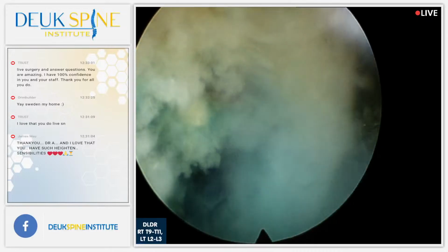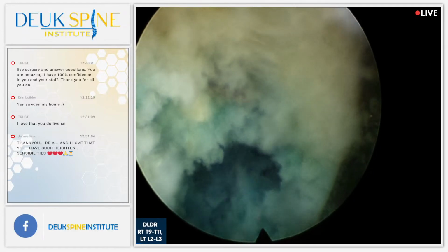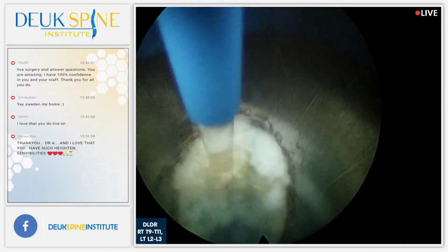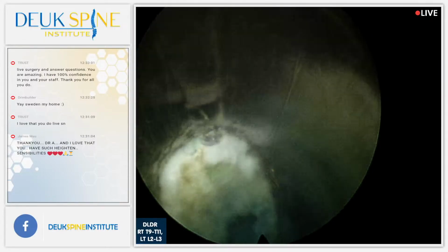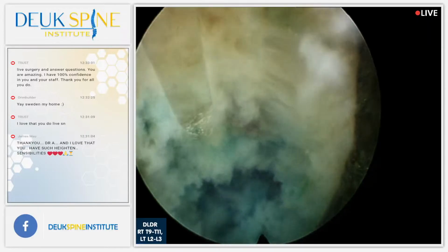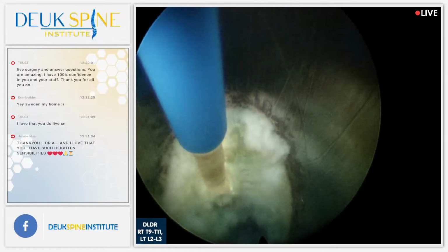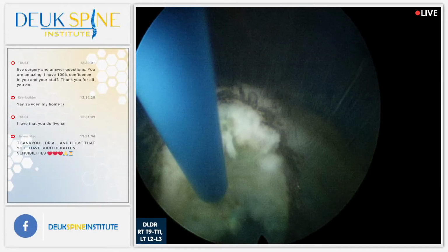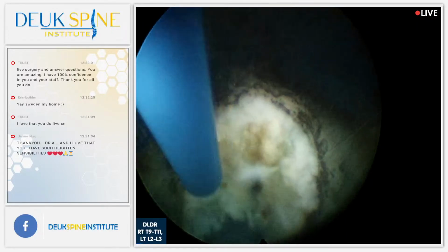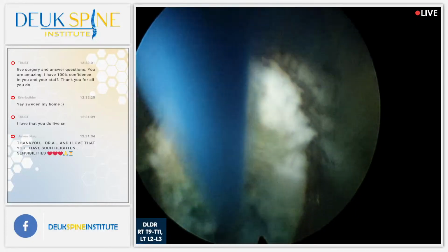By the way, you guys see that pink tissue right there? Right where the herniation, the blue meets the white? That is granulation tissue. That is the source of this patient's back pain, right there. We're going to go zap it away. The only way you can do that is if you have an endoscope. Without the endoscope, you wouldn't see that. There's no other microscope or tool or anything that lets you see it. Did you see it, Luis? That is the key to the success of our treatments, treating the source of pain.